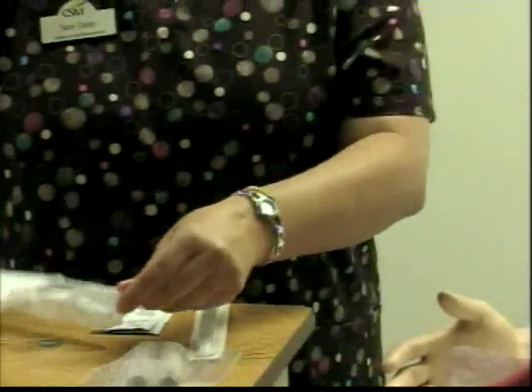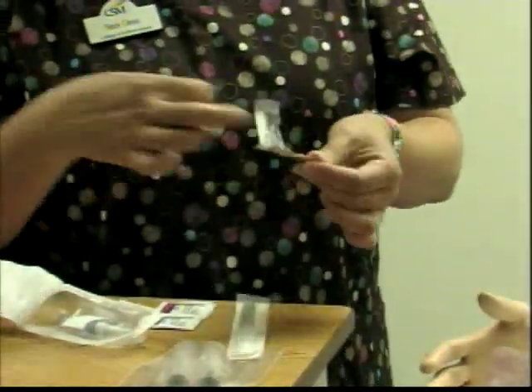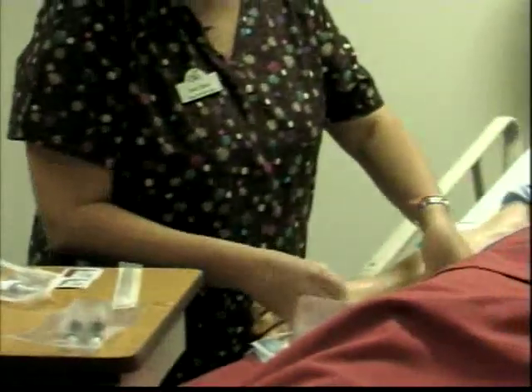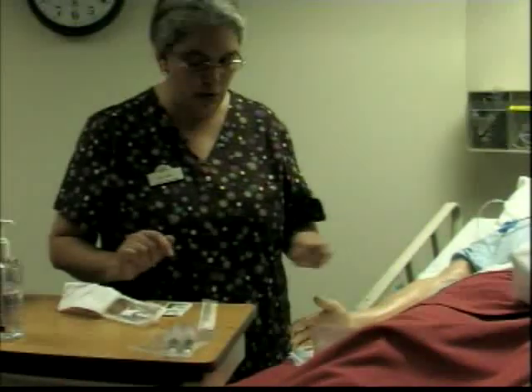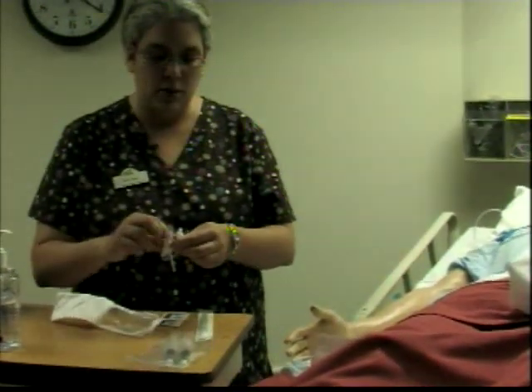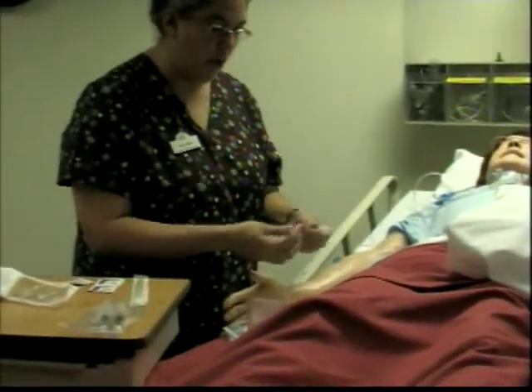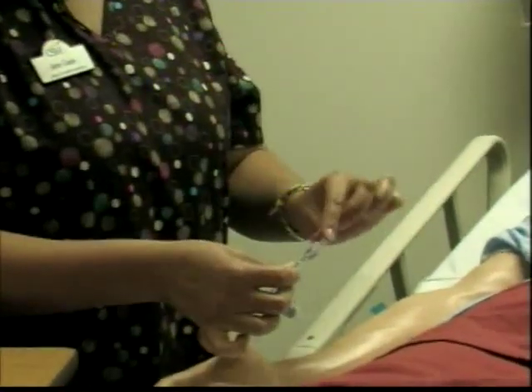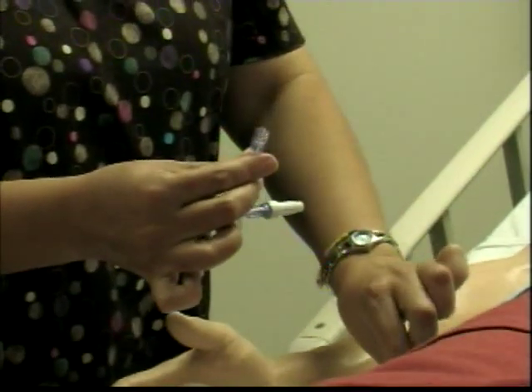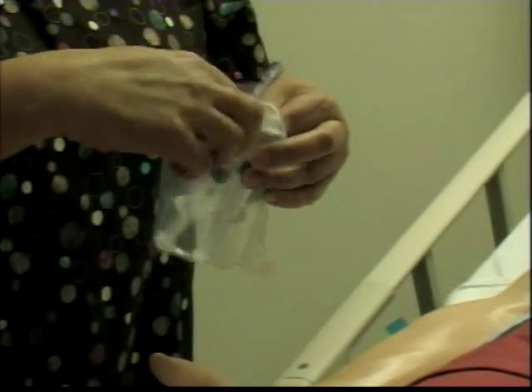You have your extension. Now this is something that you'll see a lot. Nurses will open an alcohol swab and put it close to the patient's site that you're going to puncture, so you can rest your extension and have it easily accessible. You will only have one hand when you're going to incorporate your extension into your hub, so you want to make sure that you have it available and easy access. You're going to open and you're going to connect your saline.